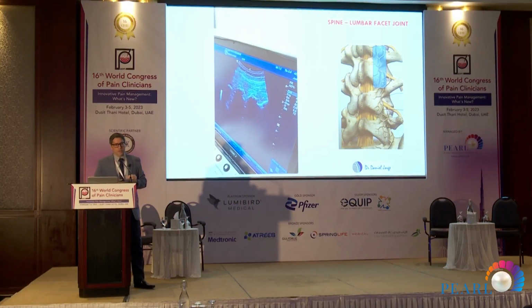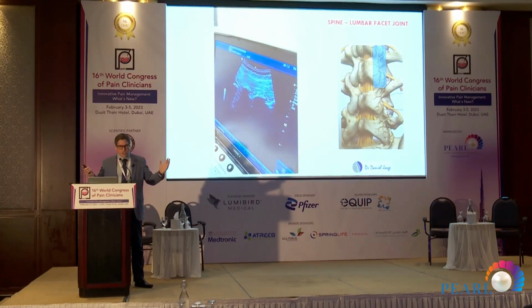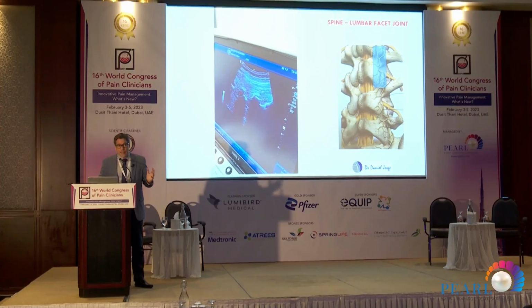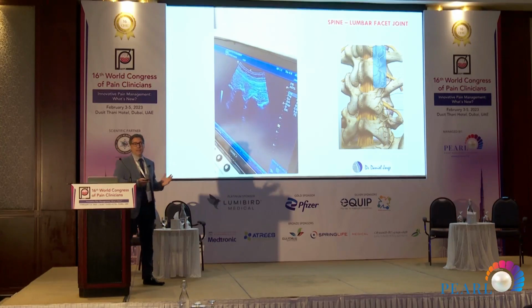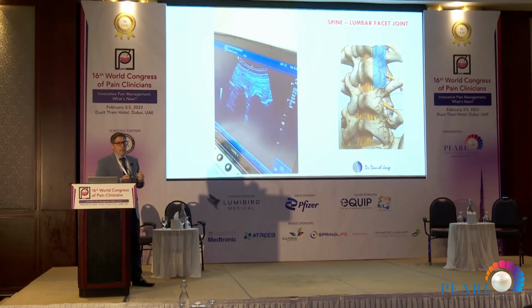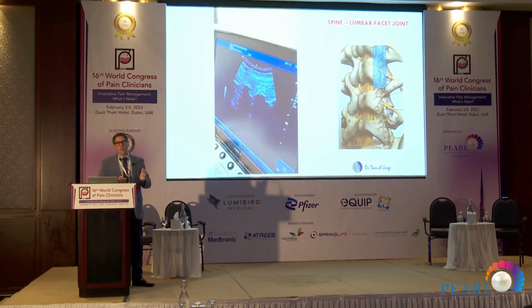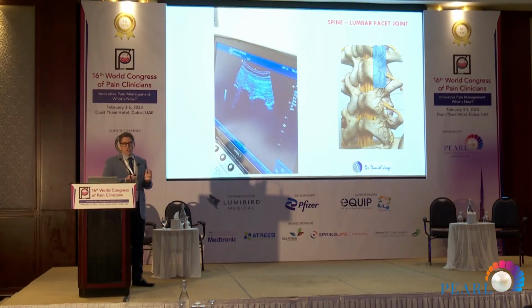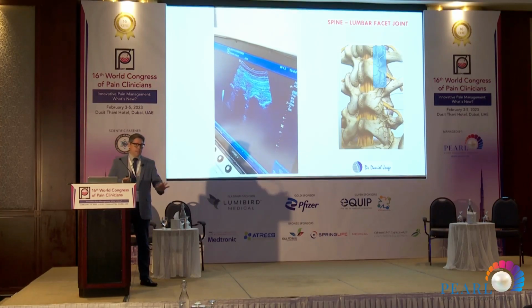I know that we are not as precise as the X-ray, but the question here is, when you're using the pulse radiofrequency, we know that we have a bigger and larger electric field than the continuous one. So then, do we have to be that precise? That's the question and discussion we can put here. Because actually, maybe not. If you're just near the nerve, it could be good enough to make your procedure, because you're making an electric field between the tip and the earth plate.